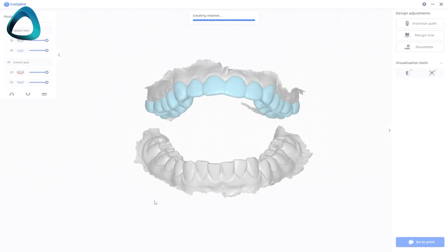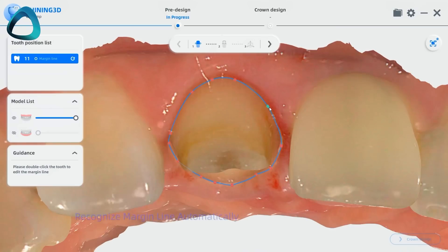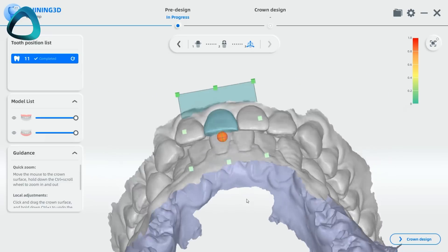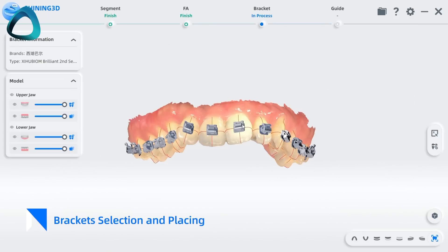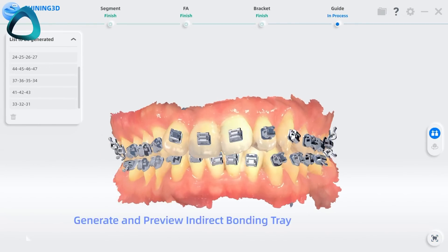Then there are all the new CAD tools in the software. Most scanners are now blurring what scanner software does and what CAD software does — and remember, this is still completely free to use. There is Cree Splint, a one-click splint or retainer CAD designer. There's also Cree Temp, a temp crown design software where, using AI after you scan your prep, you can design temp crowns for a single tooth which can be 3D printed. Lastly, Cree IBT is a workflow to design indirect bonding trays — for the ortho crowd who prefer indirect bonding of brackets — which can also be 3D printed. That's a wrap-up of all the new software features.